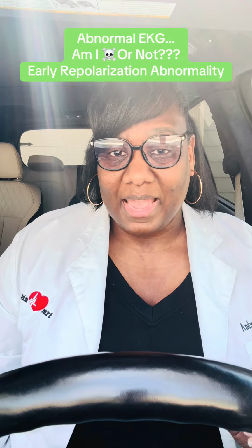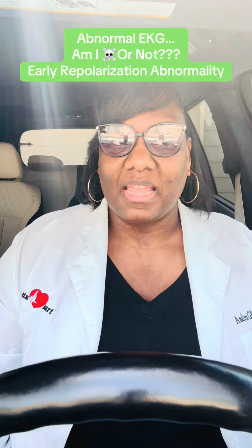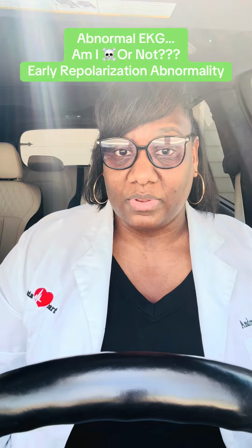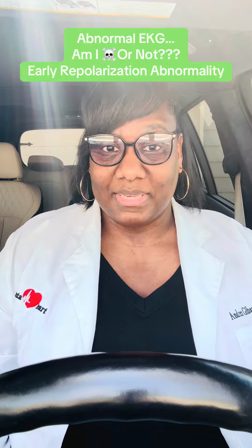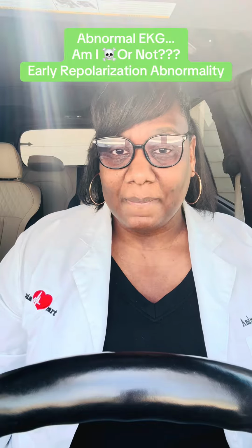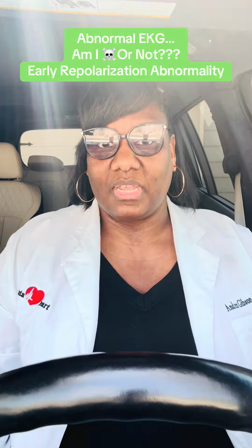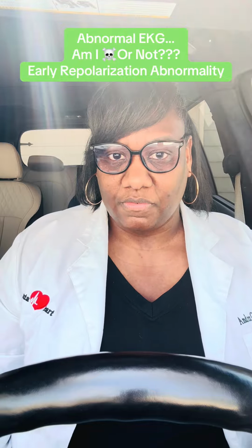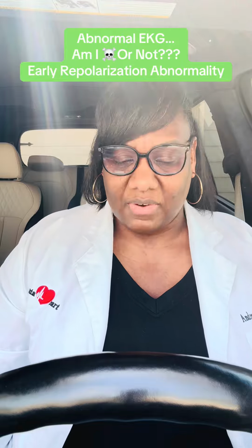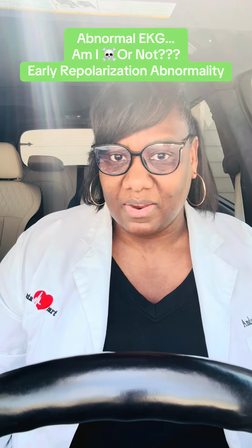Now, if your patient has no symptoms whatsoever, they've been totally asymptomatic, and this early repolarization or suspicion thereof is found on their EKG as a happenstance finding, this can be a very common variant in the younger demographic, and in cardiology, younger means under age 40. It is also very common in the athletic demographic. Very common.